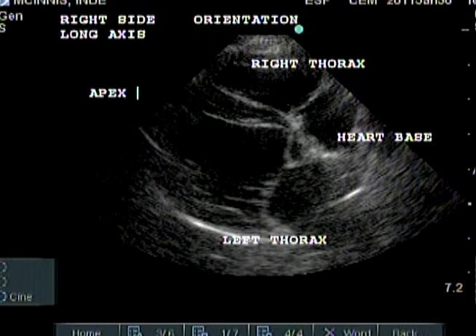Depending on the position of the heart in the patient's thorax, the index indicator may be pointing cranially, a cranial oblique, or dorsally. So the right side of the ultrasound screen could be cranial, cranial oblique, or dorsal, and the left side of the screen is the opposite direction.